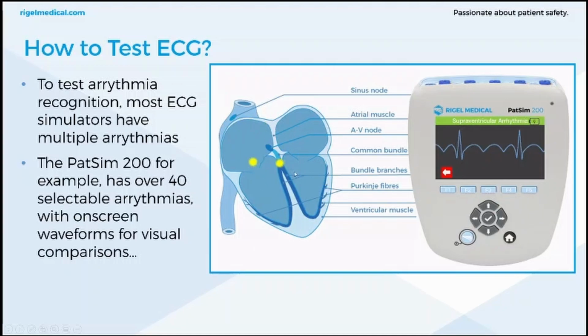The ventricles limit the trigger, so it's getting multiple triggers, but the ventricles are actually limiting this. As a protective measure, it's limiting the trigger and how many QRS complexes are being generated. And that's why you see this periodic QRS complex between this loop in the atria, demonstrated on screen.